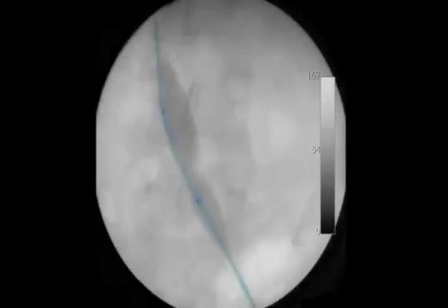This is a guide wire inside of the vein. This is a fluoro image now with only x-rays. It's not ultrasound. This is the spine, the spinal column going straight up and down. And at the lumbar 4, lumbar 5 interface is where the iliac vein divides, and here you see a balloon at that L4, L5 space, and you see a waist in the balloon. That means as the balloon is expanding, it's being constrained by that iliac vein compression site.